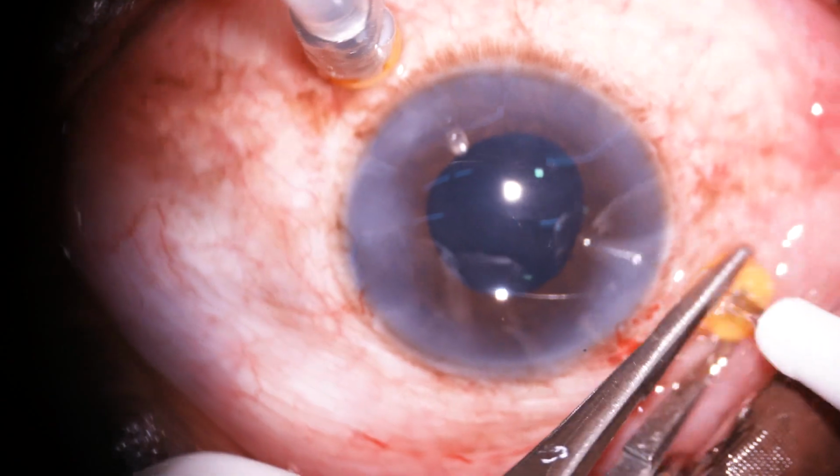In the first scenario, a 3-port pars plana vitrectomy has been done. Core vitrectomy with truncation of the central cone and a posterior vitreous detachment has been completed. The posterior hyaloid staining with intravitreal triamcinolone is done.